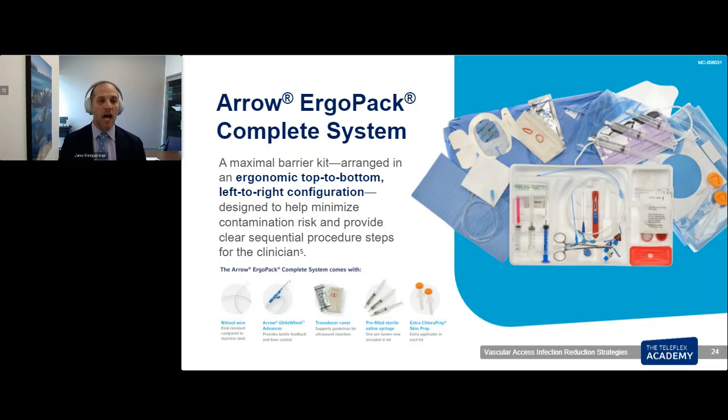It has the Arrow glide wheel advancer, which helps more smoothly advance the wire. It has an ultrasound transducer cover in sterile gel. It has pre-filled sterile saline syringes that are already open on the field, so nothing has to be dropped on the field where you are risking contamination. And it has extra ChloraPrep skin prep, which allows you to really clean the site well prior to and after insertion of the central line.